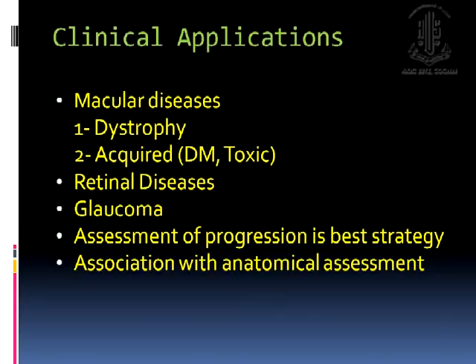The clinical application of the multifocal ERG is probably obvious, which is the macular diseases. You can highlight some dystrophies, especially if they are congenital. You can highlight acquired problems like diabetes, or toxicity for the macula. You can start your baseline and follow up your patient and try to compare.